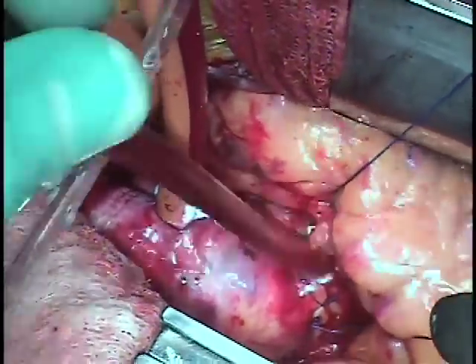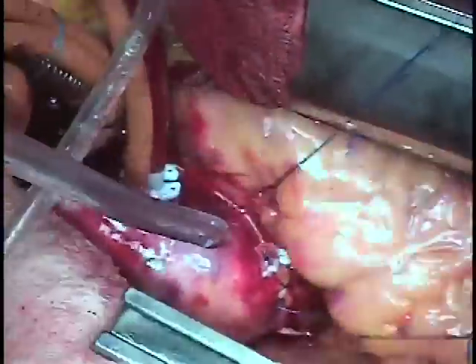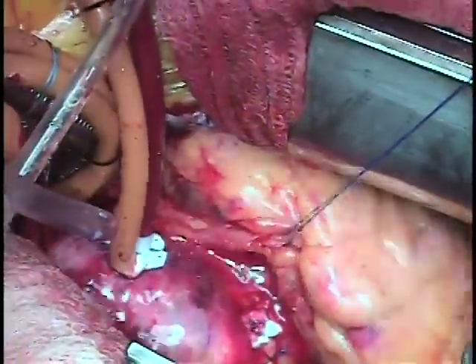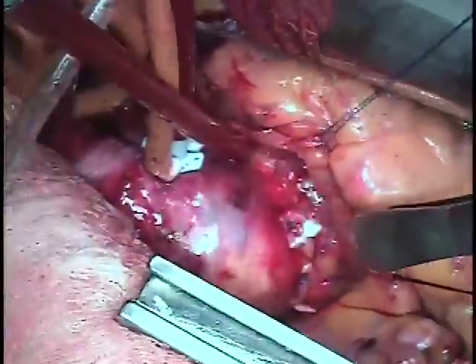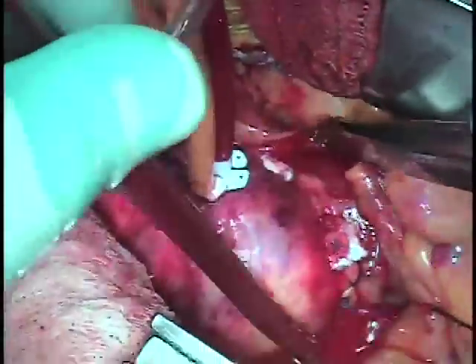The heart is fibrillating here and we will give it a shock to get it back into a normal rhythm. People sometimes worry about that, but the heart virtually always gets back into a normal rhythm once we shock it.